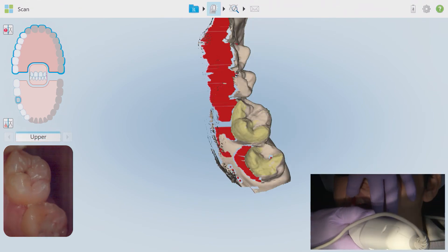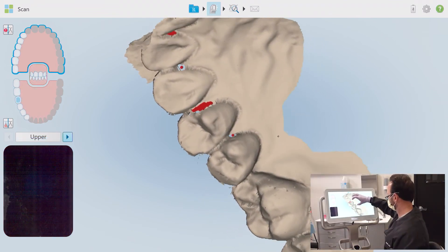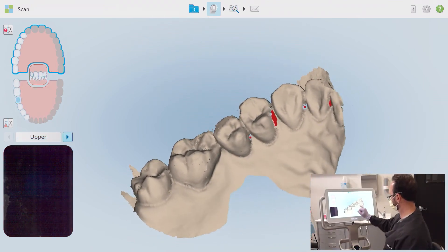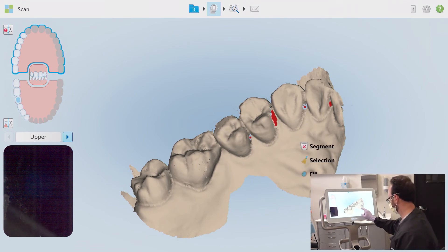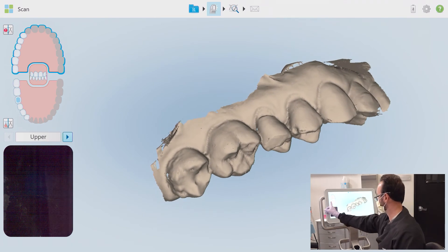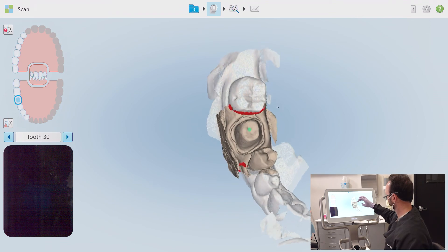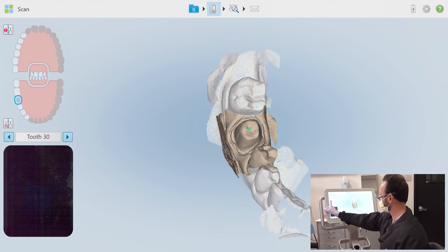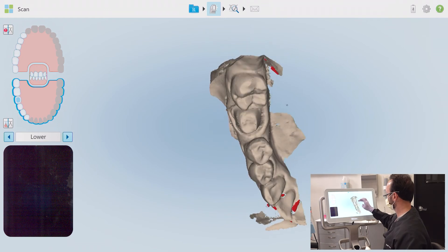I'm always starting again on the previously scanned occlusal surface until the iTero recognizes the segment and meshes, then wrapping around to the buccal and moving towards the anterior where I'll stop. A quick review shows small areas that need to be filled — I'll select the fill option and give them a quick once-over to complete. From here I'm going to review all scans up to this point. I'm not worried about those red contact indicators on this prep scan because my full working quadrant scan shows those areas are complete.